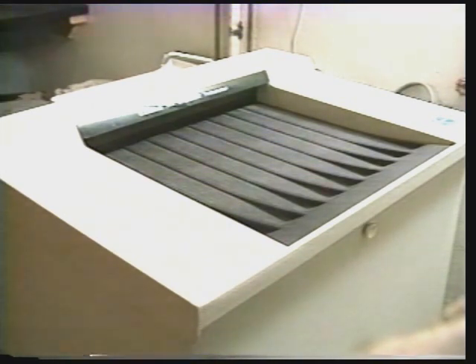The darkroom also is a place where variables will kill you if you're not real careful. You must have a clean environment. You do not want dust in your screens. Do not open your cassettes wide open, so that the dust that is settling out of the air, that's been put in the air because you slammed the door, goes into your screens. Open your cassette on the side, pull the film out, close it, put it in the processor. If you're hand dipping, the same technique is used. Do not open your cassettes wide open in the room. Your developer and your fixer must be fresh.